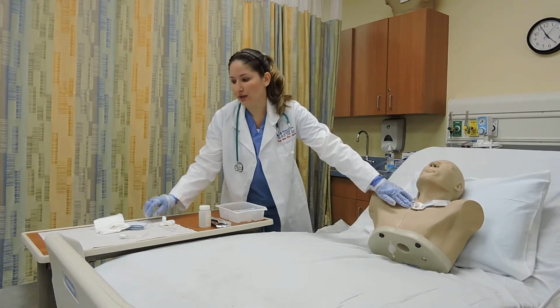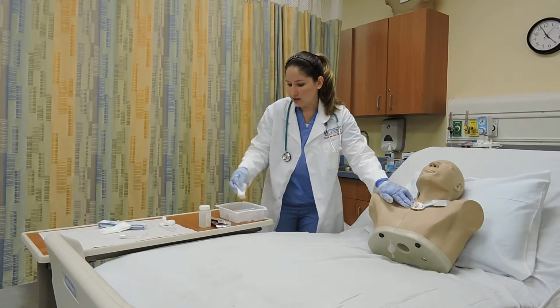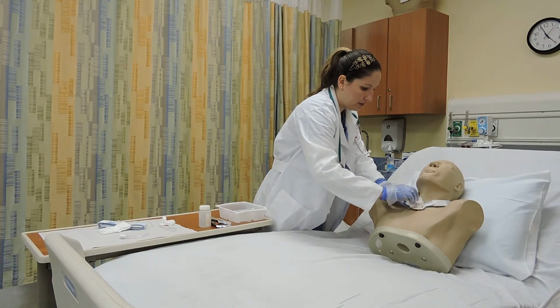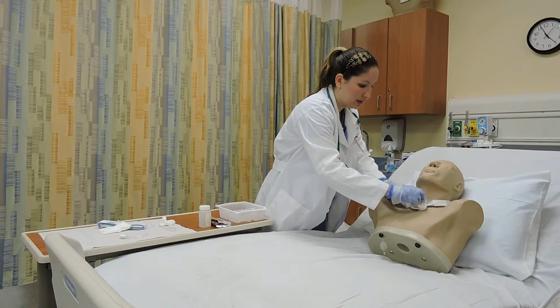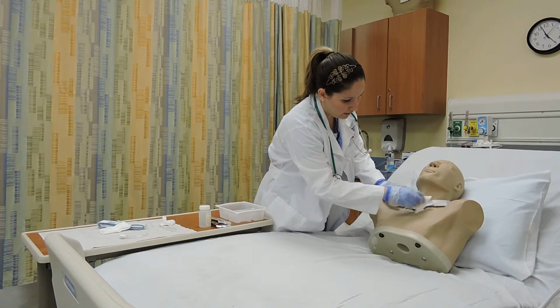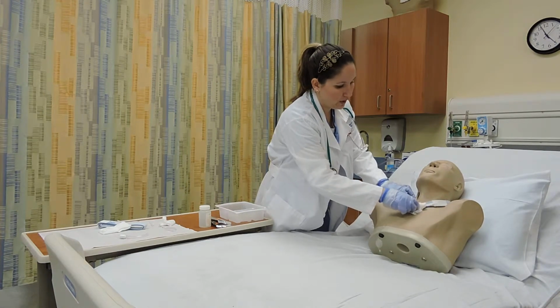Okay, always make sure that we rinse it off. We need to rinse the hydrogen peroxide, because if we leave it on the patient, it can cause the skin to get irritated and itchy. So we dip the gauze into just sterile water, and now we're rinsing off any excess of hydrogen peroxide.